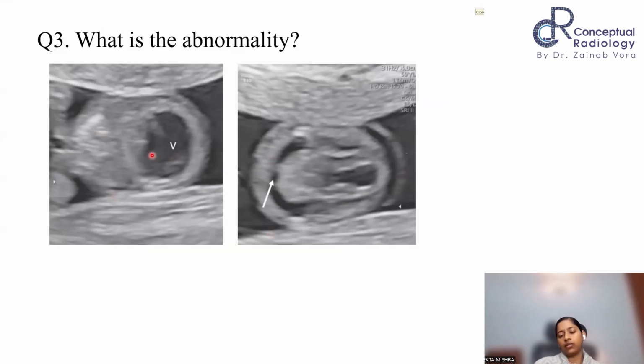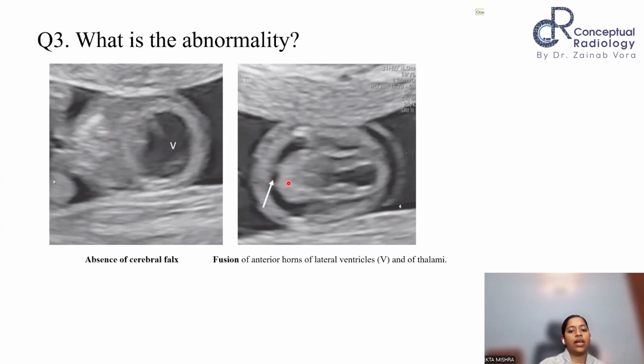Early pregnancy scan. You were doing NT and NB, started focusing on the head. I don't see a structure in the midline. No, early pregnancy. I'm not looking for the corpus callosum at this point of time. Do you remember we see nice butterfly-like structures? Very good. So common cavity. I'm not able to see the interhemispheric falx. Not seen. Here also I'm not seeing the falx. So the falx is gone and you have fused thalami and a single ventricle, monoventricle. Diagnosis?